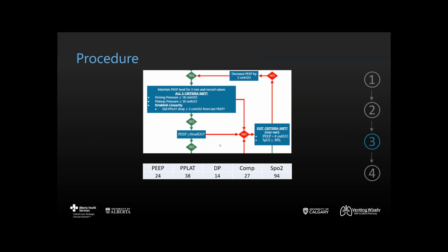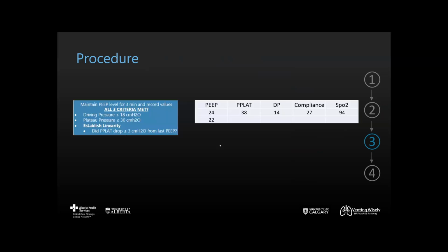Is our PEEP equal to 8 centimeters of water? No. Is our saturation less than or equal to 80%? No. Then follow the red no to the next step of decreasing the PEEP by 2 centimeters of water and repeat. Set it and check it.